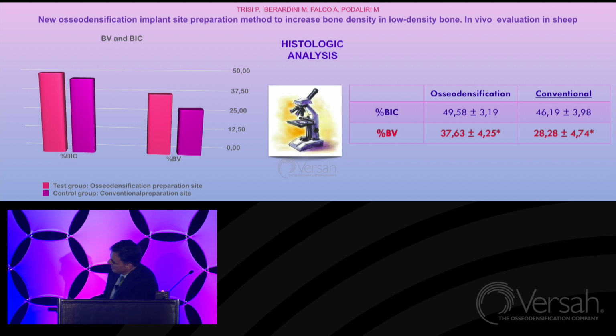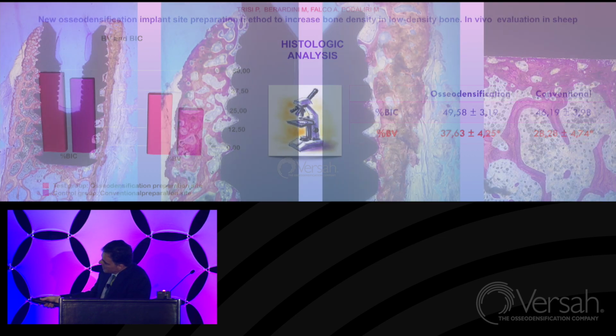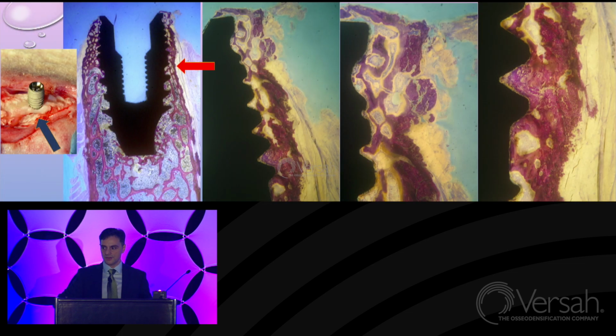And these are the histologic pictures, where you can see this bone around the implants. I would like to focus with you on this area. Here, the shape of the crest is changing. Can you see? There is a change in the direction. This is the area where the crest was expanded.